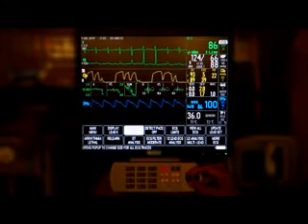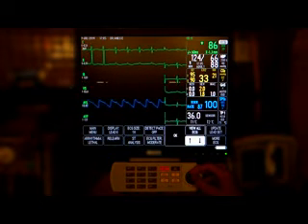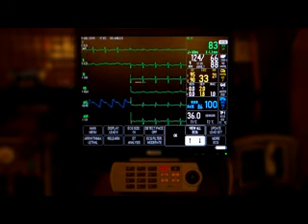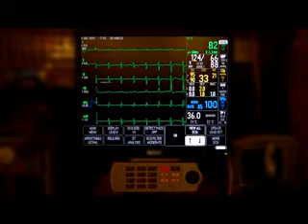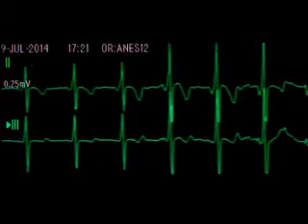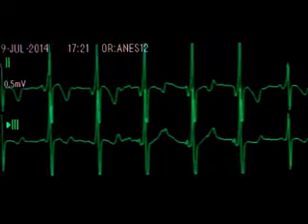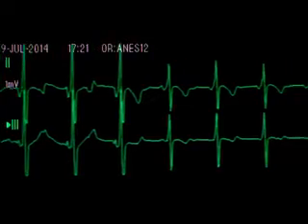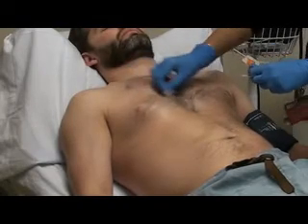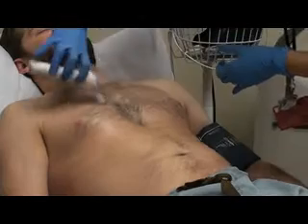Most ECG monitors display one or two waveforms at the top of the screen. If desired, additional waveforms can be displayed. A menu on the monitor may allow modification of the amplitude of the graph to optimize viewing of waveforms. In addition to the ECG equipment, you may need alcohol wipes and a razor.